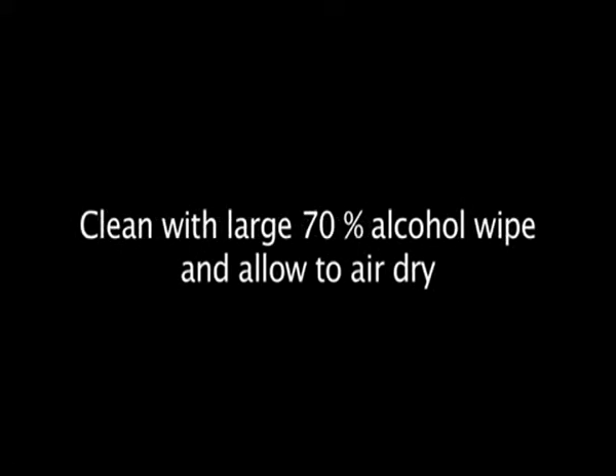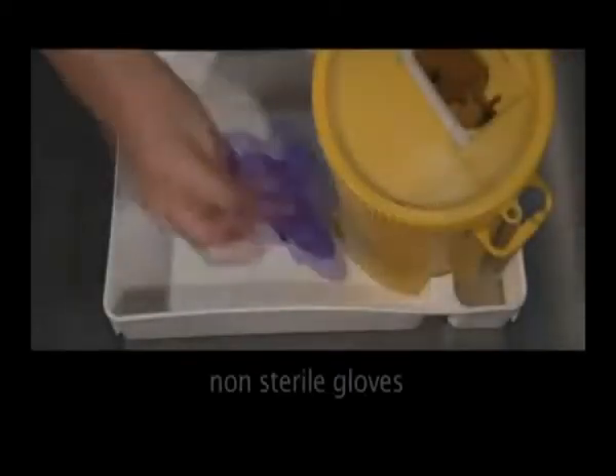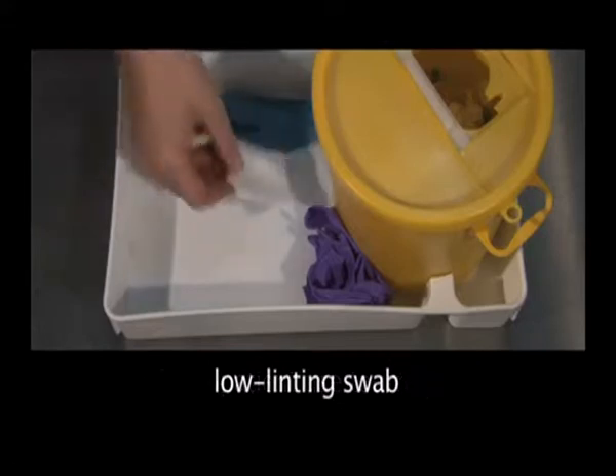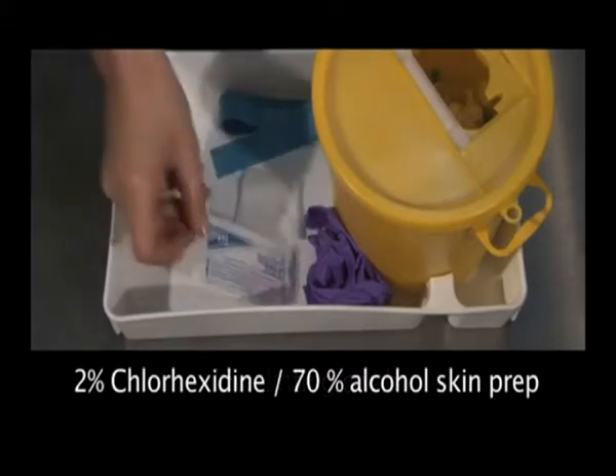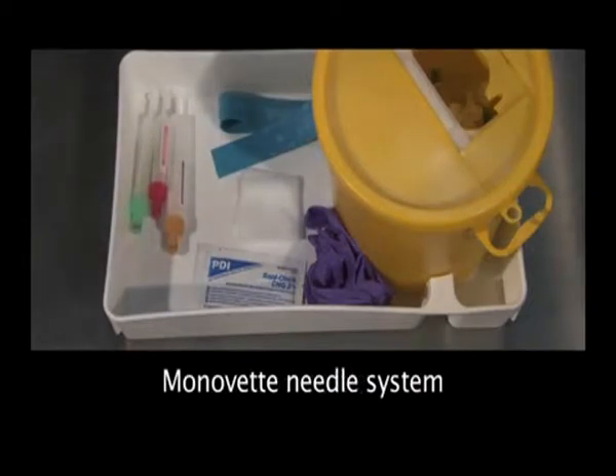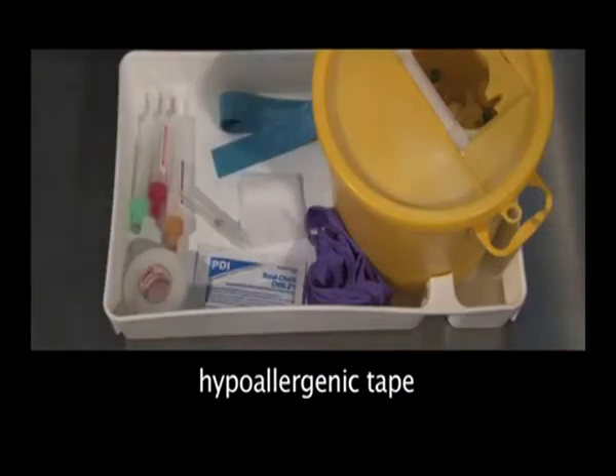I'm going to go away and get the equipment and then I'll come back and we'll take that blood from you. Hi Kelly, I've come now to take that blood from you that we were talking about earlier. Have you got any questions? No, I'm just a bit frightened of needles, but I'll look away if that's all right.